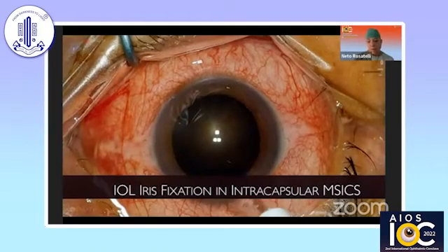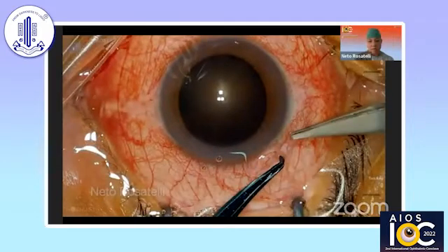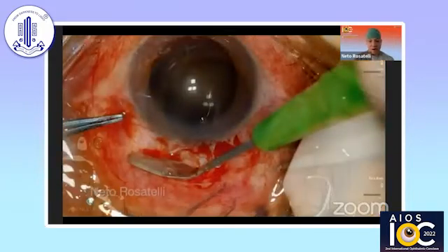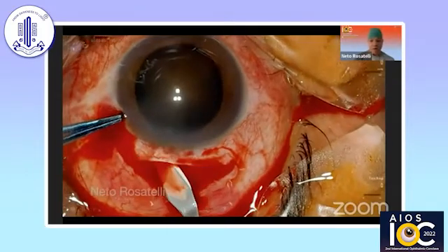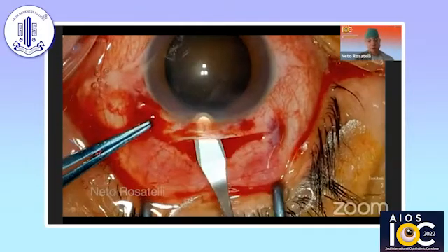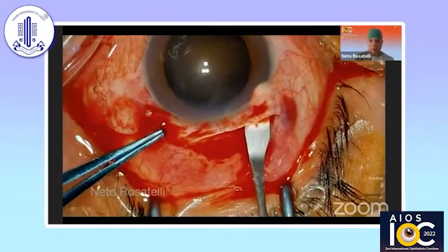So I'm going to show you a case. It's a very mature cataract, almost a Morgagnian cataract. The approach is by a standard MSICS technique with only a few modifications. I apologize for the heavy editing — it's a long surgery, but it will serve the purpose of showing how it is done.